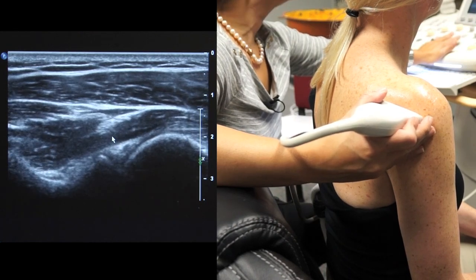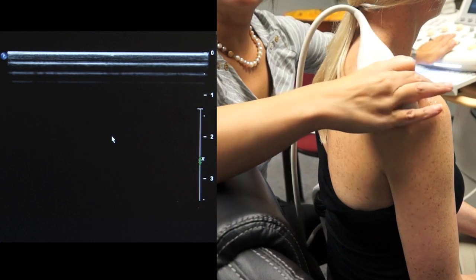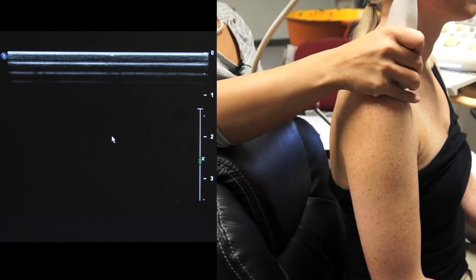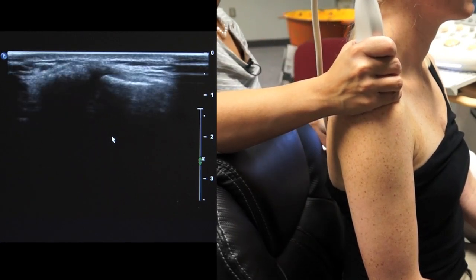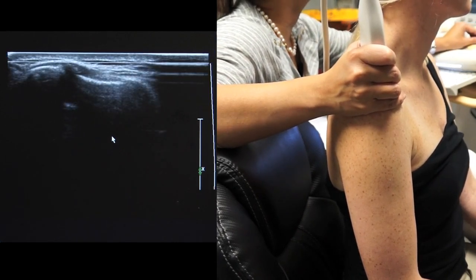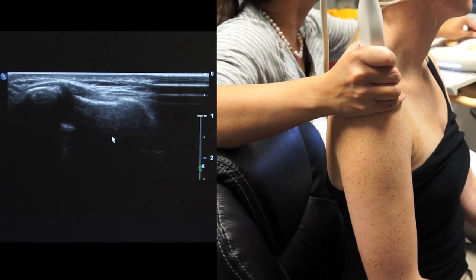One other thing to look at is the acromioclavicular joint. You can either palpate the bony landmarks right here and orient your transducer across the acromion and the clavicle. Now this is a more superficial structure, so again we want to adjust our depth and move our focus up.